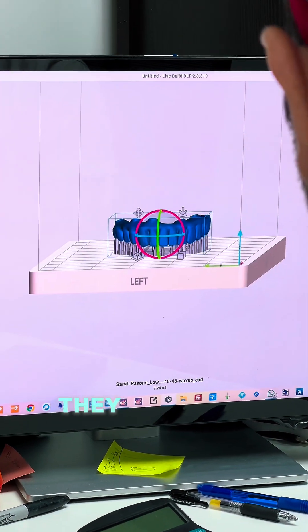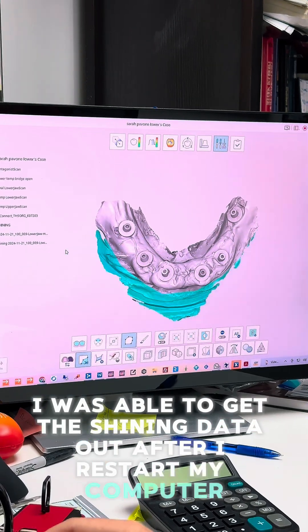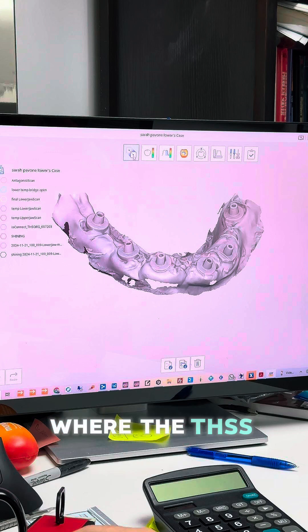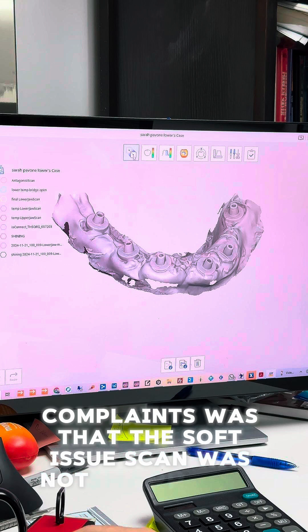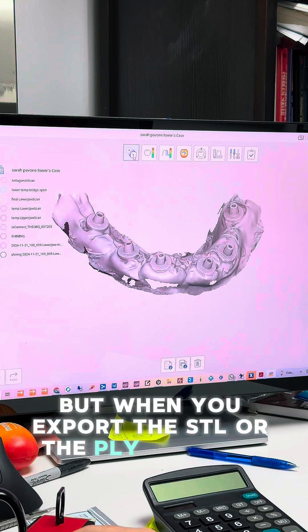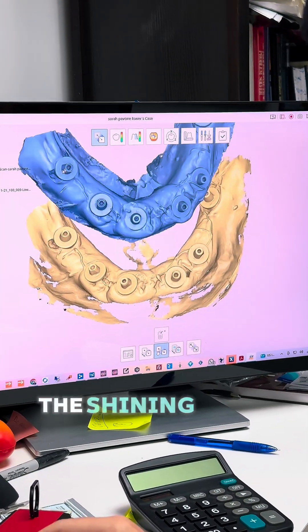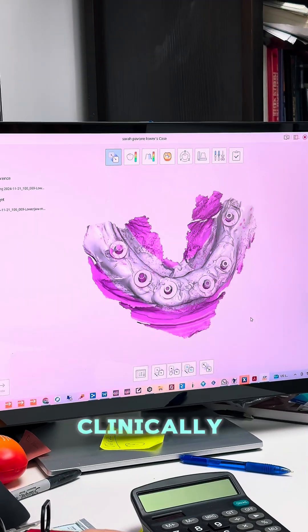They average about 22 to 25 minutes each. I was able to get the Shining data out after restarting my computer - thank God it was still there. You can see it looks really great compared to last time. Interestingly, in their viewer the scan looks horrendous, but when you export the STL it looks really sharp - almost sharper than the Trios. So I aligned everything together: the Trios scan, the Shining scan, the Shining photogrammetry scan, and the IO Connect scan. Everything is almost perfectly clinically aligned.